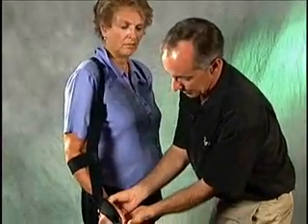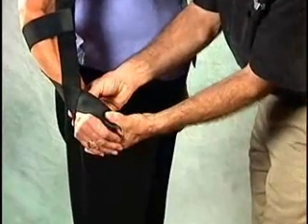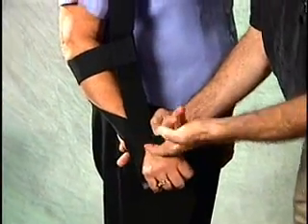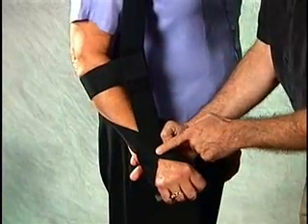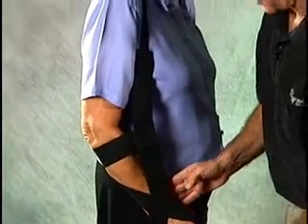Now in fitting the handle, you want to make sure that the handle, which is oval in cross section, is fit snugly up into the web space between the thumb and the first finger. The cross should be over the dorsal surface of the wrist, and the elbow strap should be about an inch to two inches distal to the olecranon.